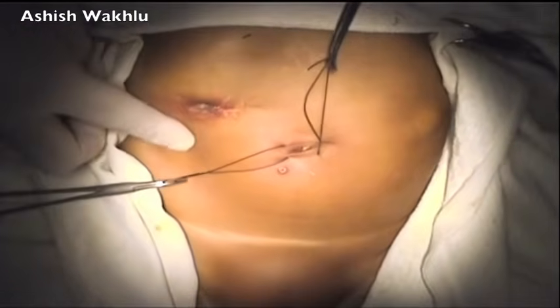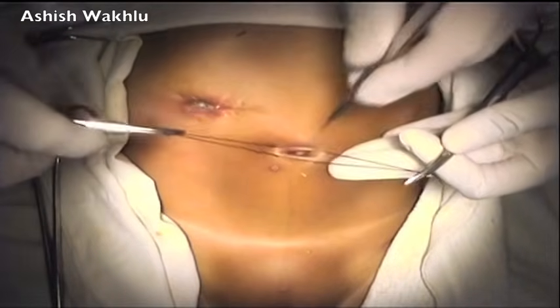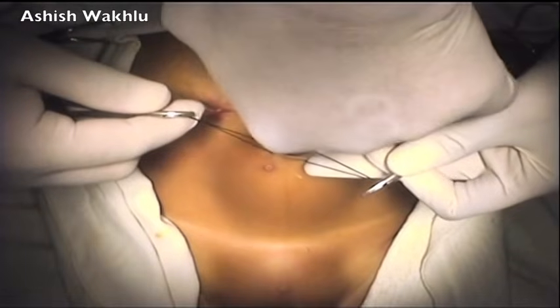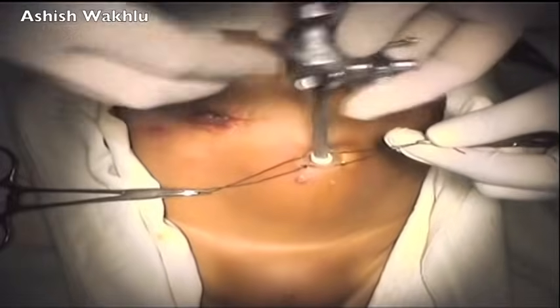Here is the local anesthetic being infiltrated into the left abdominal port position. The umbilicus was entered with a number 11 scalpel blade. The opening was dilated a little, and a 5 mm trocar inserted and sutured in position.